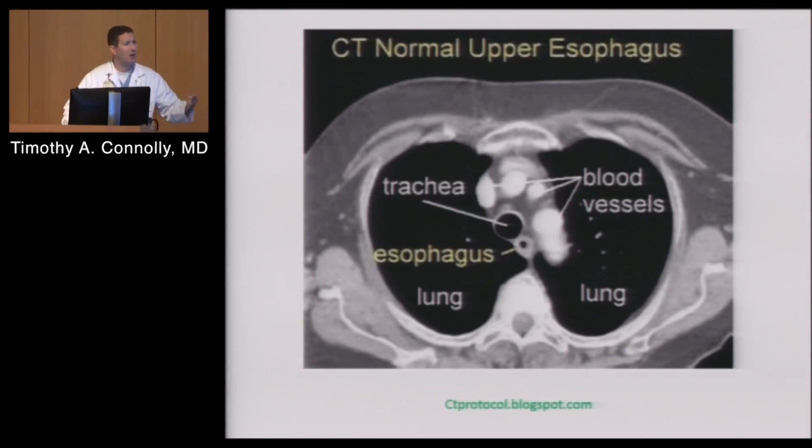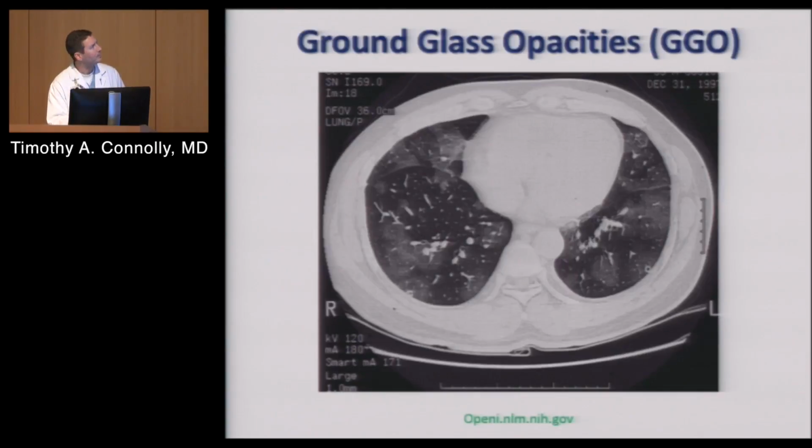If you're following up a lung nodule, no need for contrast. First image off of an abnormal chest x-ray and you're worried about a possible cancer or nodule or growth, you probably do need contrast. So you have to understand what it is you're looking at and trying to tease out to determine yay or nay on contrast. Because again, people have kidney dysfunction, it means they have to get a creatinine first, it's harder for them to handle, and if it's not needed, don't put them through it.